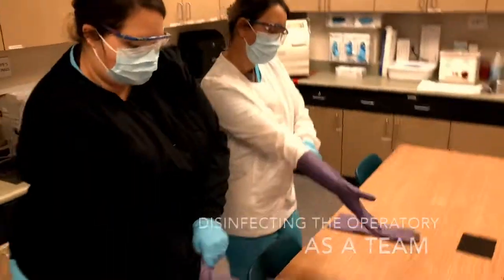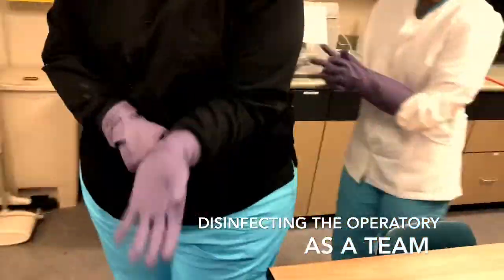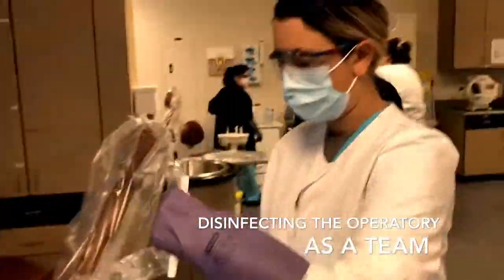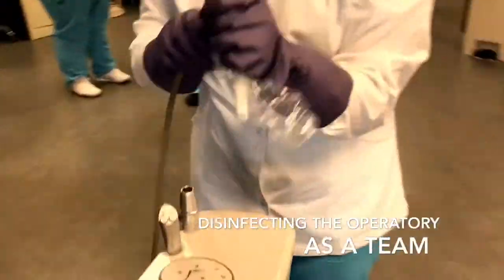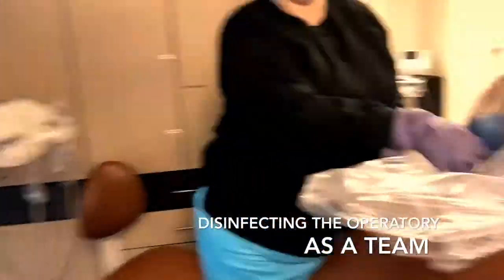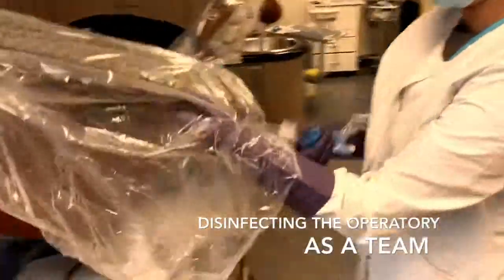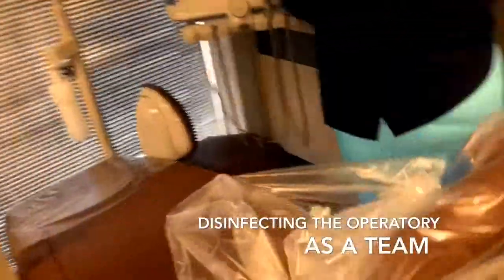And here we have Samantha and Ali getting ready to disinfect the operatory room. They're placing on their utility gloves and they're getting ready to go in there as a team. They're trying to make everything move a lot quicker together. And here we have Ali removing all the barriers and Samantha's taking the instruments to get sterilized. Samantha begins on taking down the entire room, and she's throwing everything away. Again, always try to move as quick as possible and always try to work as a team, because together we could accomplish anything.